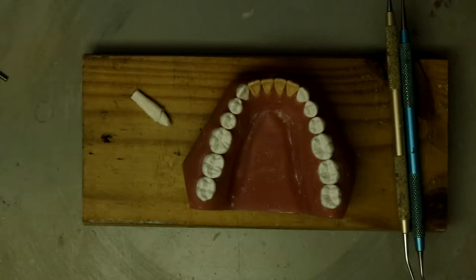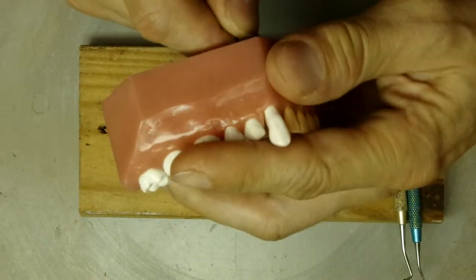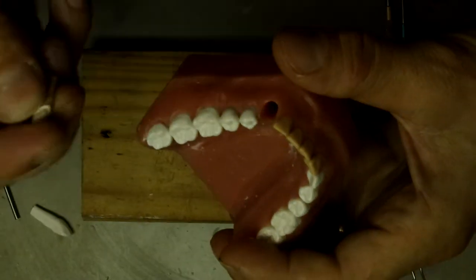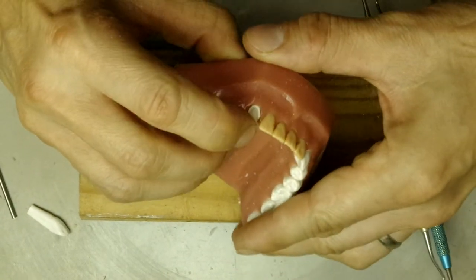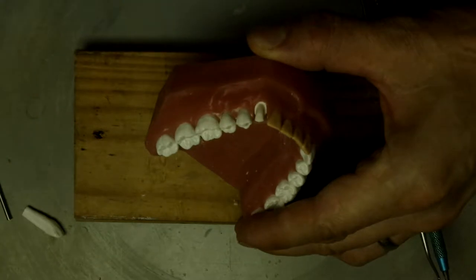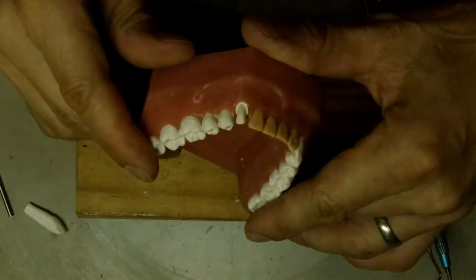Alright guys, the next tooth we're going to do is number 22, lower left canine, or the mandibular left canine, tooth number 22. Make sure our margins go all the way down, both lingual and labial.